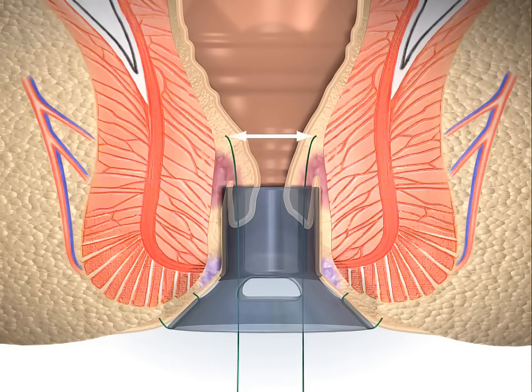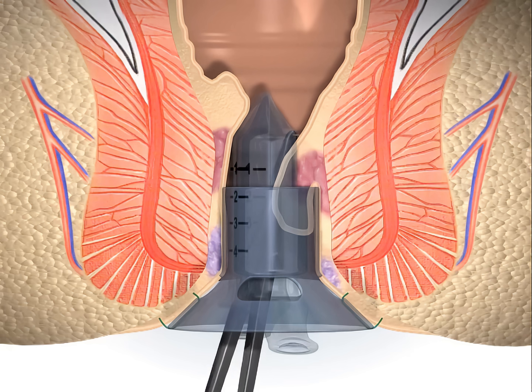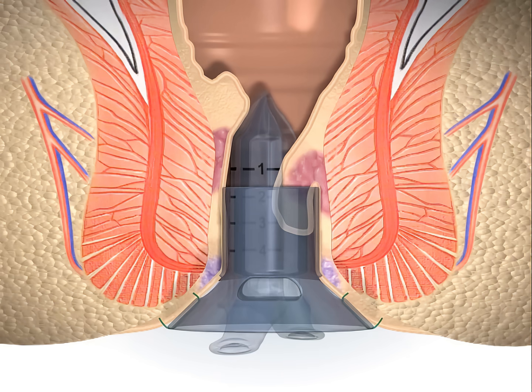The purse-string should be at the same level circumferentially. At each stitch, the purse-string suture anoscope is extracted, then rotated and inserted again. Rotating the anoscope while it is fully inserted in the circular anal dilator can twist the mucosa and cause an improper asymmetric purse-string suture.